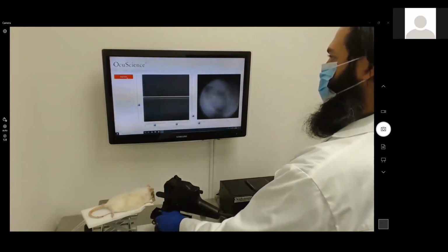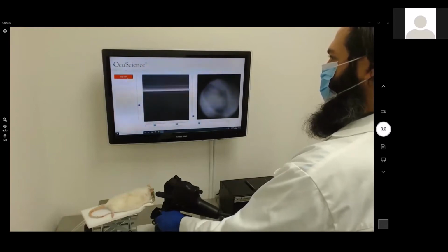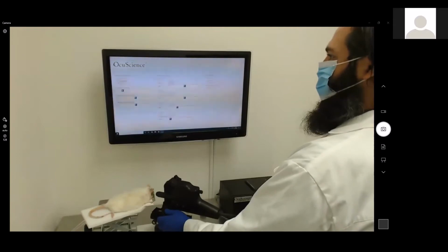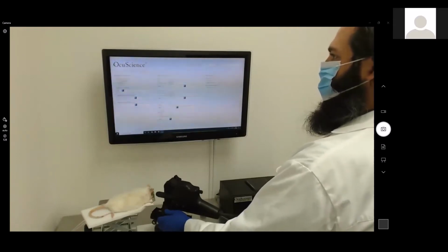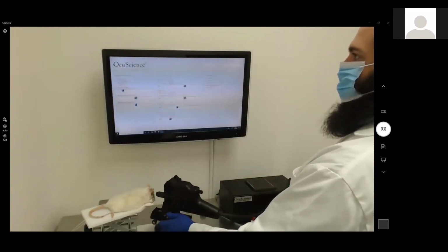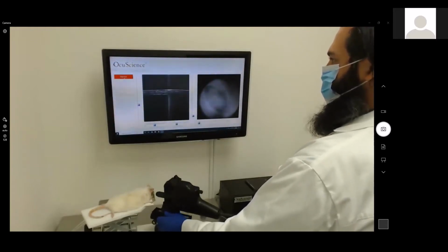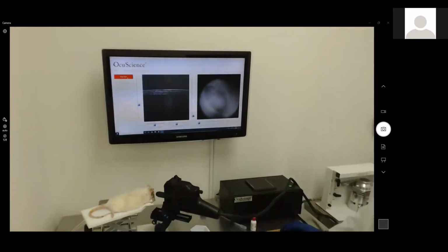Back up. Your width is not right. Yeah, zero width. Too far. Zero width. Too narrow. That's good. All right. There. So now that's a more zoomed in segment of the cornea as well. You can stop that and we can save those corneal layers as well.